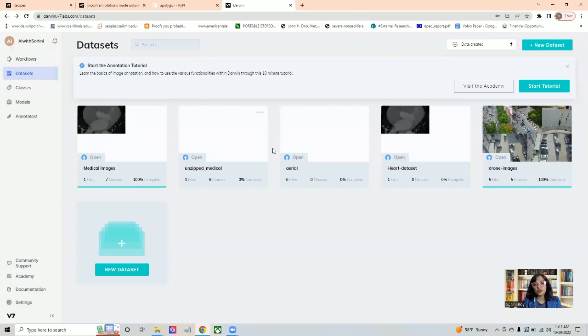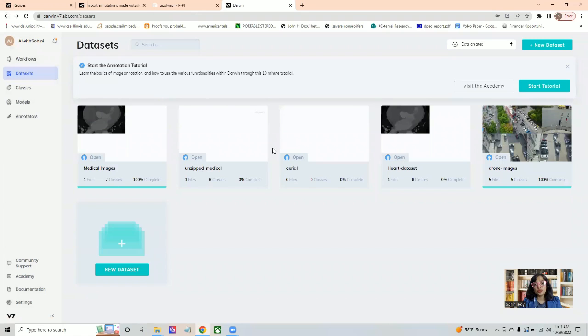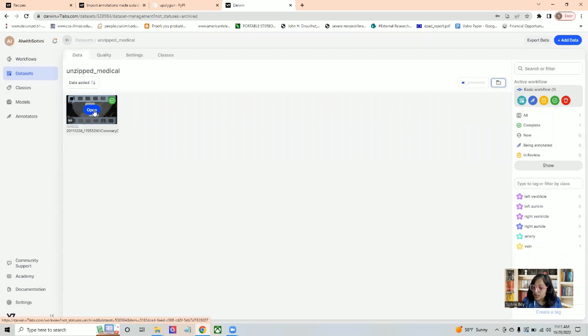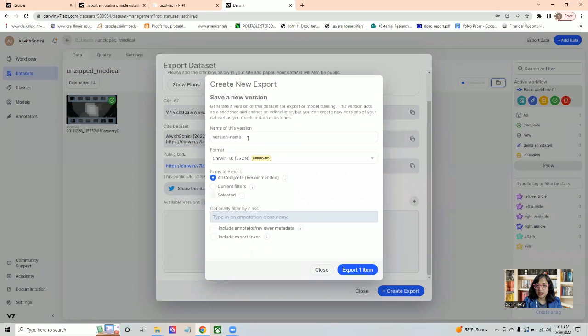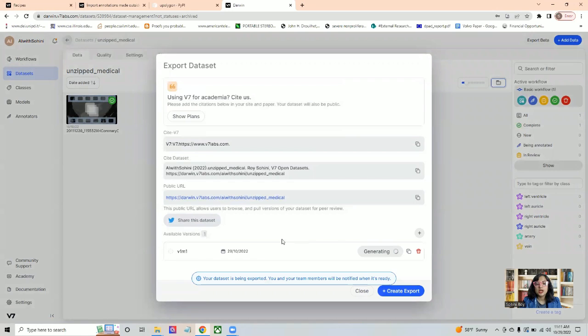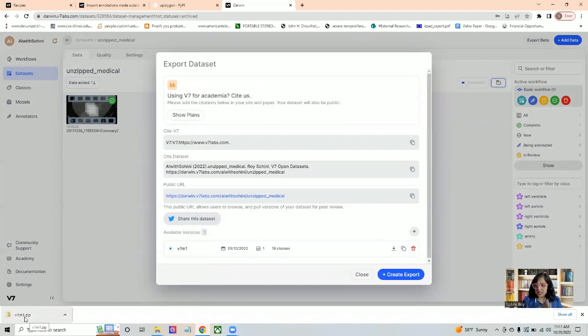One thing that I did want to mention is if you have volumetric semantic segmentations, then exporting volumetric semantic segmentations, you can only do that in the JSON format. If you export this particular data, create an export, and call it v1m1 and export one item, you will see that it is generating and it will only generate this in the JSON format.